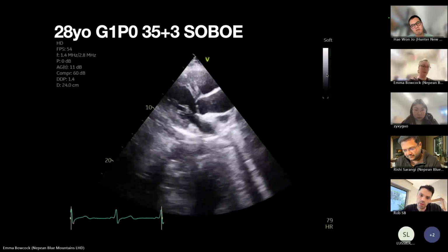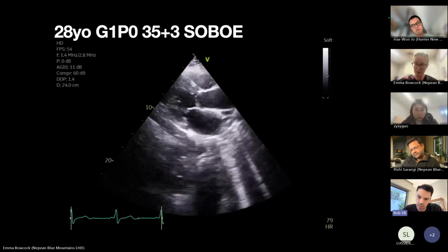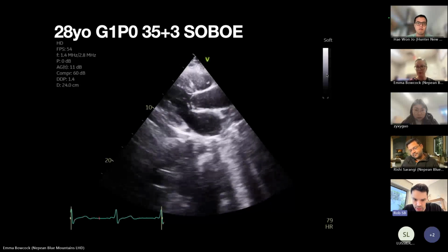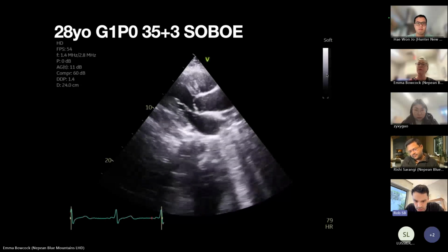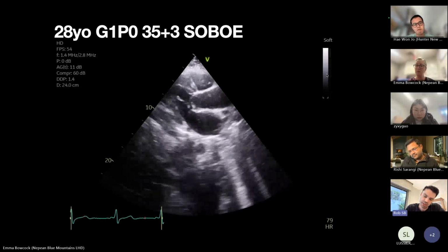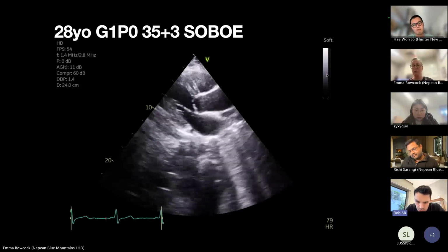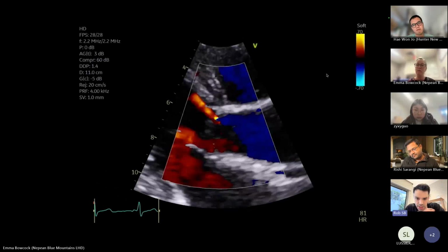The concerning feature is the aortic valve and potentially even the aortic root. I'd like to look at that in a more focused view with reduced depth. It appears like there's an abnormality there, with both of the leaflets potentially just being cut off axis or maybe even flailing into the ventricle. Like I said, I'd like to see that in more detail, zoomed in.